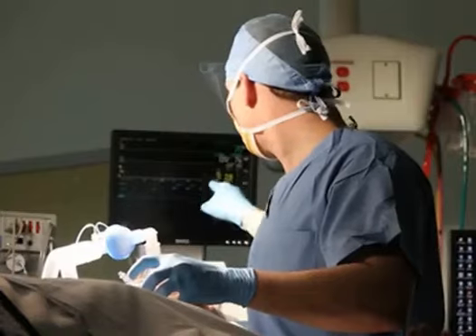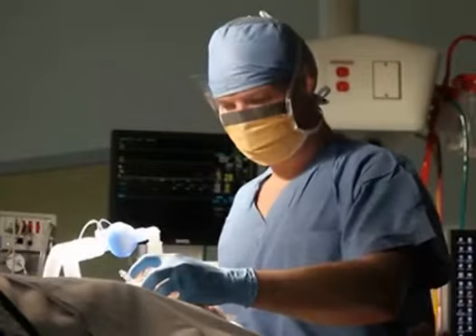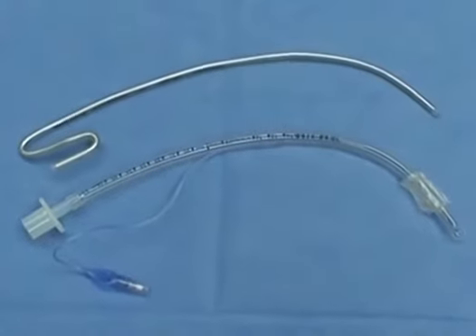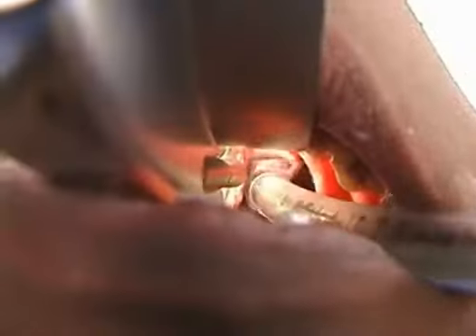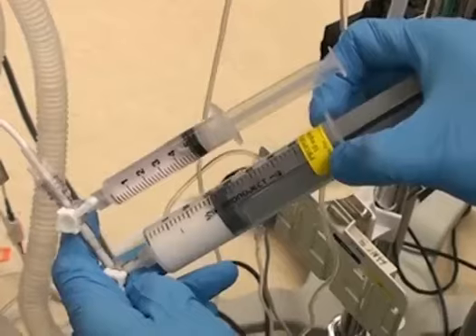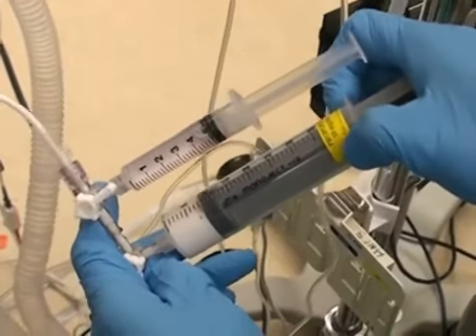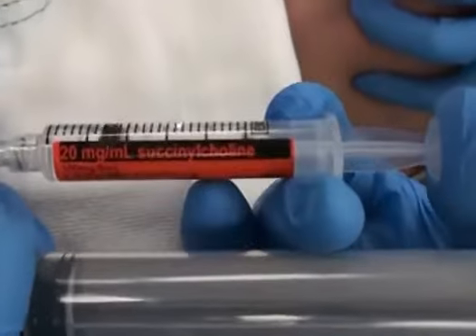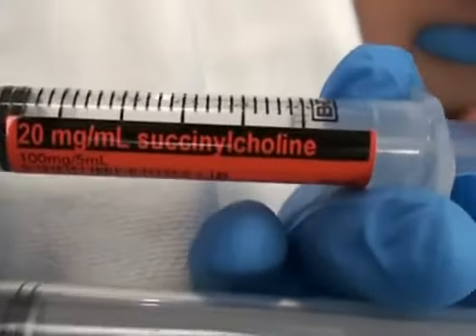The patient's vital signs should be monitored continuously. A laryngoscope, endotracheal tubes, and stylets should be available in case immediate reintubation of the trachea is necessary. An induction agent, such as propofol, and a muscle relaxant, such as succinylcholine, may facilitate emergency reintubation.